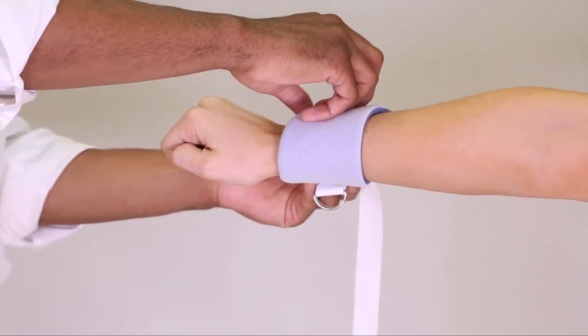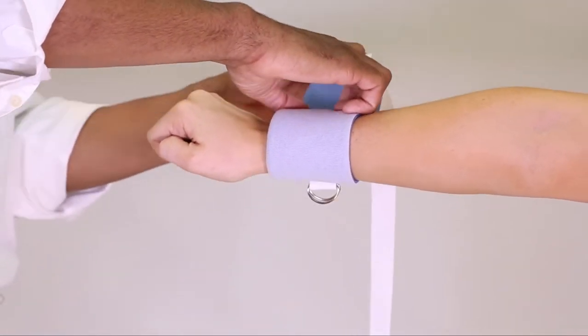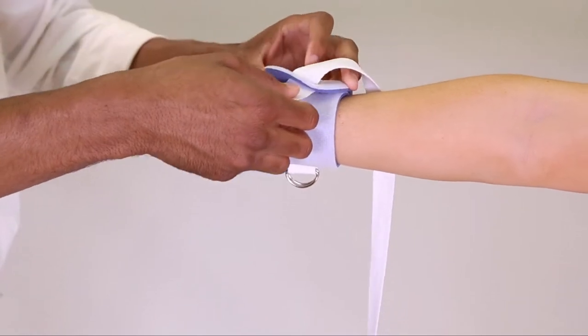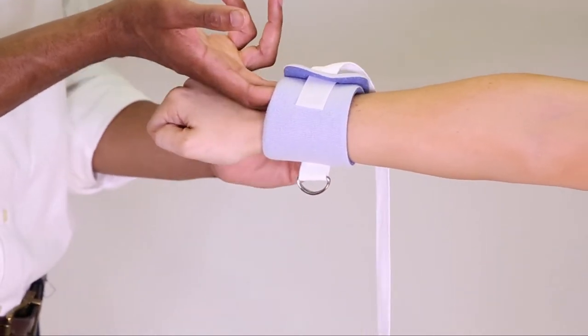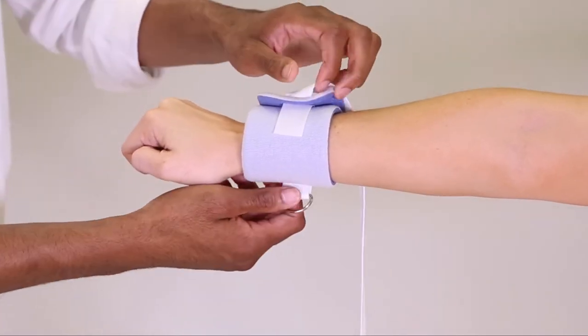To apply the cuff to the wrist, make sure the cuff closure is on the outside of the device. Secure the hook tab to the cuff. Make sure two fingers fit between the device and the patient.